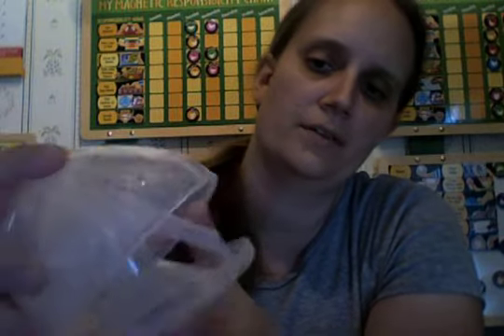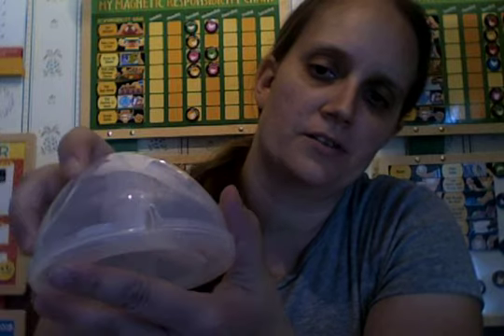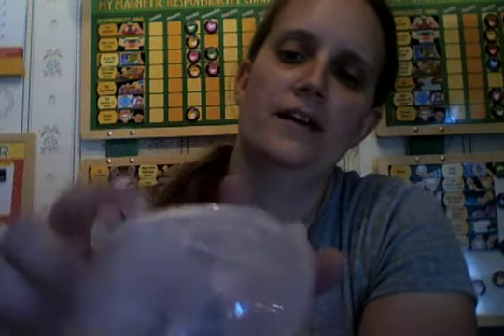Here's the cup. There's also a hole right there in the cup. You line that up with that. So you make a hole. So see, there's access, and your tubing goes straight in there. When you put these together, line that up, and you're going to hear a click. If you don't hear the click, don't use it. Go boil them again, because they're not going to be tight and it's going to leak. You should always hear that click when you go to put them together.